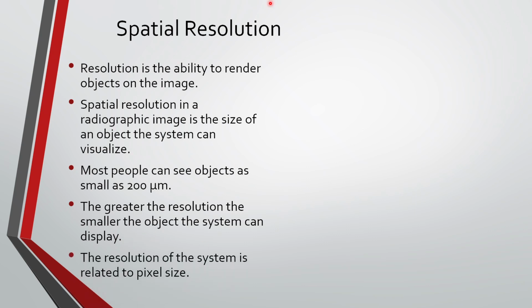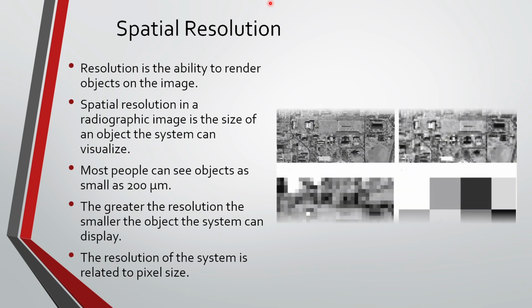The resolution of the system is related to the pixel size, okay? So the smaller the pixel size, the greater the resolution, okay? The greater the pixel density, also the greater the resolution, okay? That's like the pixels per inch, okay?